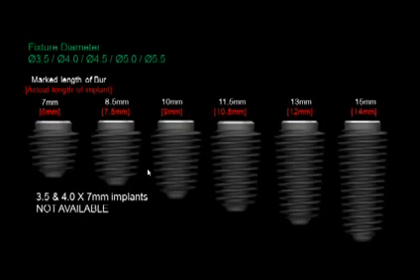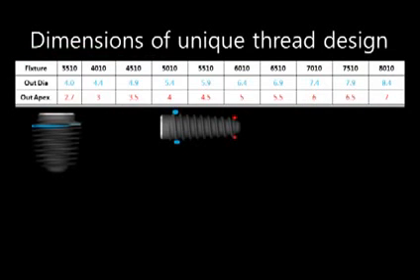Again, after you've performed your osteotomies, let's use your 10mm standard. Your 10mm implant is actually a written length of 9. That ensures you're able to place your implant 1mm subcrestal. You don't have to. You can leave it bone level if you so choose, but you are able to place it 1mm subcrestal. Now, this factor that I'm about to talk about here is very, very key.